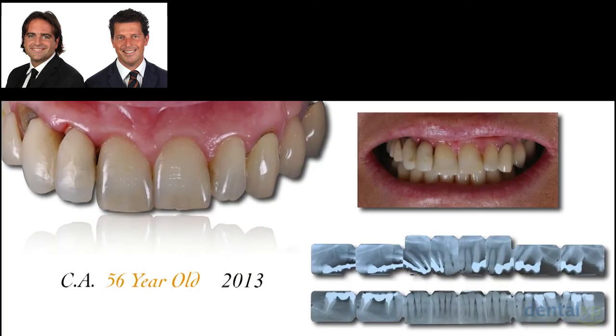But the question that might arise is whether this innovative approach could be predictable also for full mouth rehabilitation. To answer this question, a 56-year-old female patient is now described, who presented at the first visit saying she was not able to chew anymore because of the continuous dislodgement of the upper right bridge and the absence of the upper left bridge, performed 10 years before.